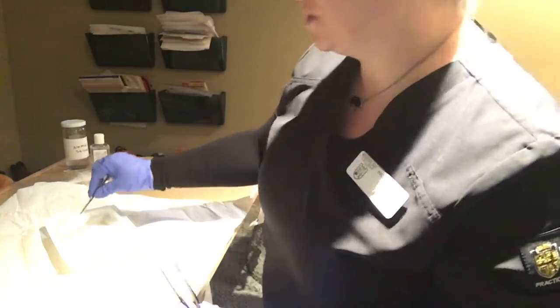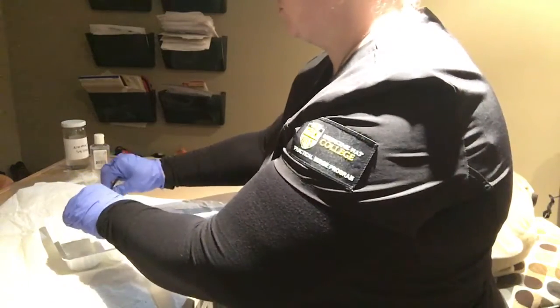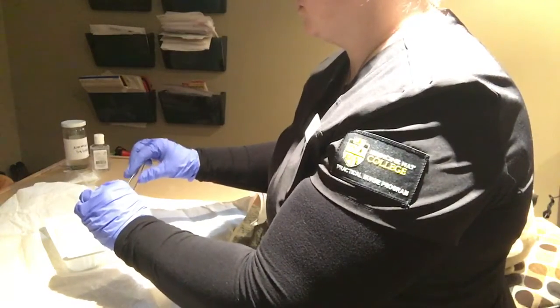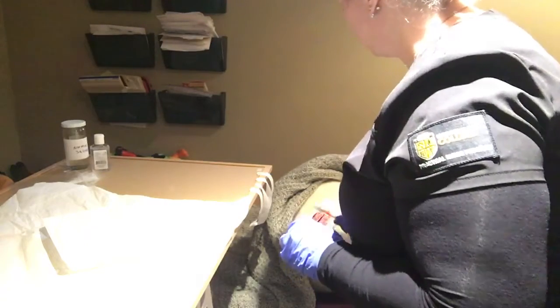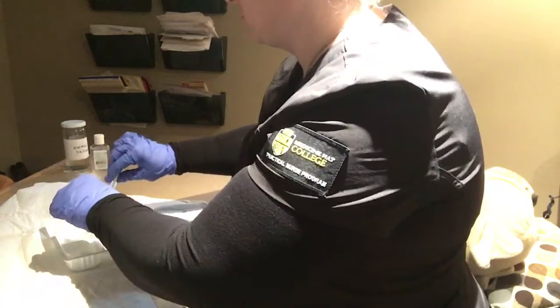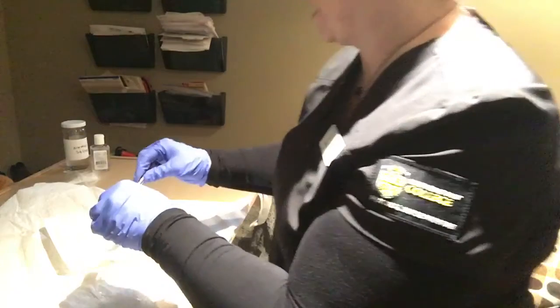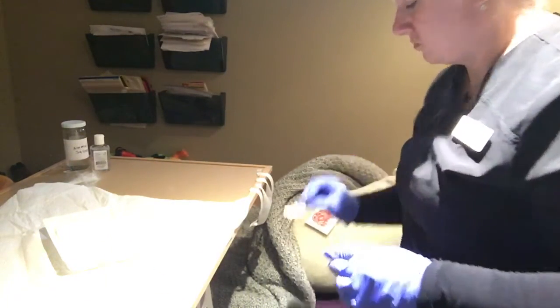And now I'm going to dab it dry. Okay, I'm going to dab it again. My wound has been cleansed and now dried.